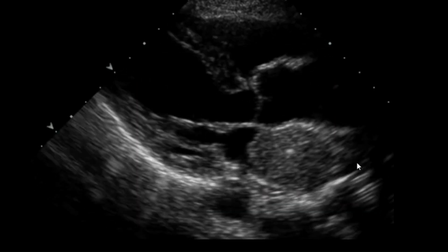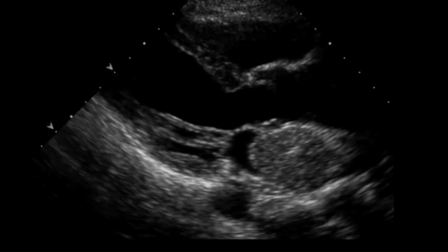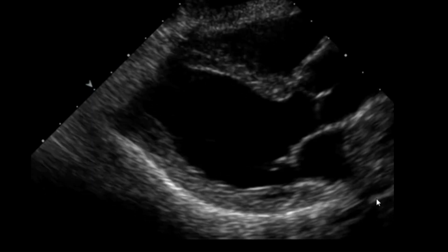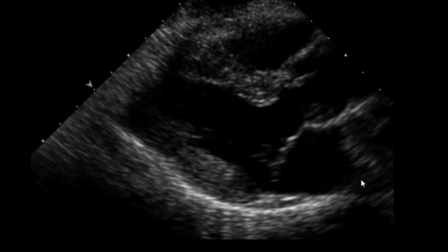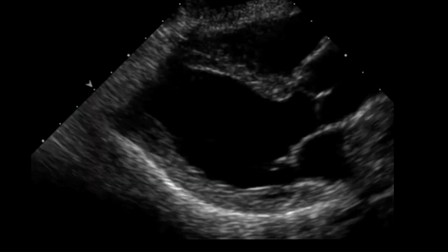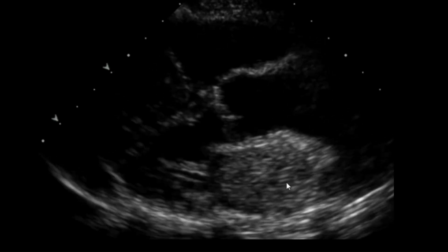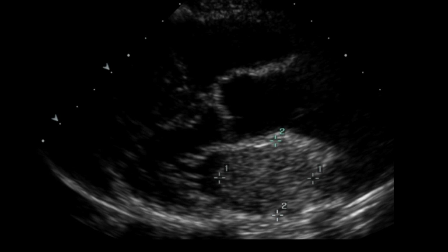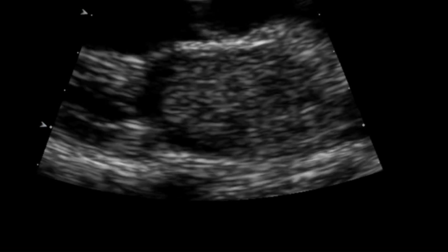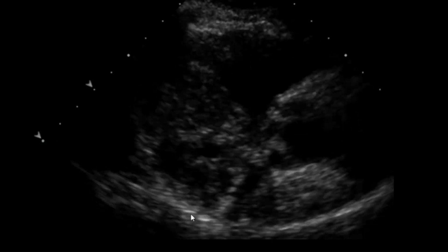In the study from 2010, it's quite obvious immediately there's a very large left atrial mass there. Interestingly though, if you just tilt over a little bit, the mass actually is not particularly obvious at all, and you can see some abnormality at the back of the picture there. And when you actually centre the structure, you can see it's quite large with a broad attachment. It's nearly 4 centimetres across from that view, and it appears relatively fixed when you look at the image there.